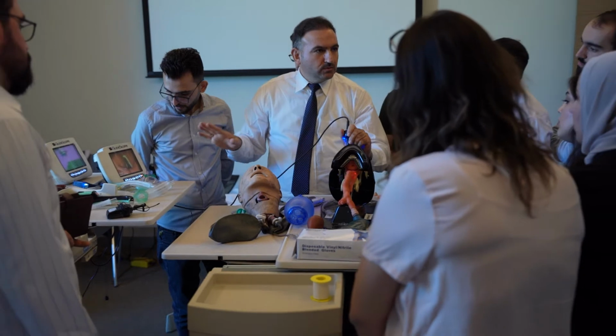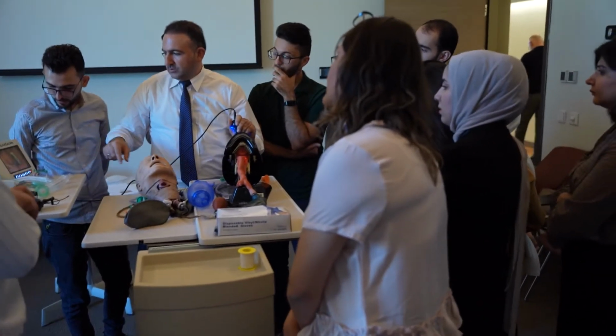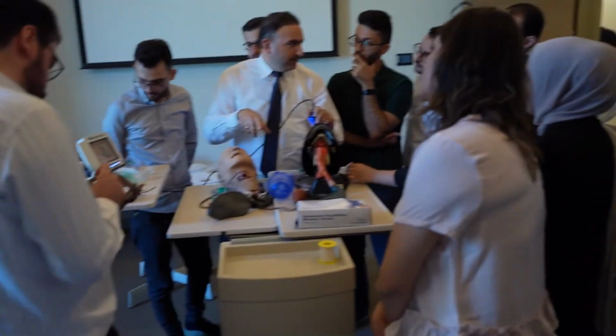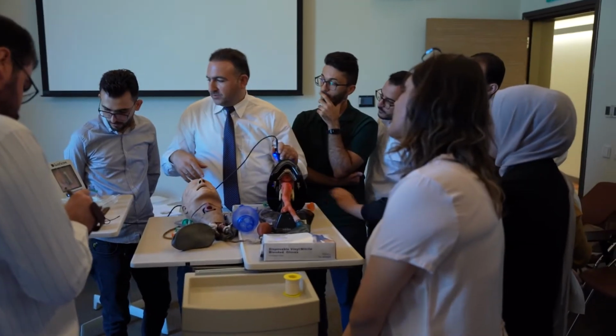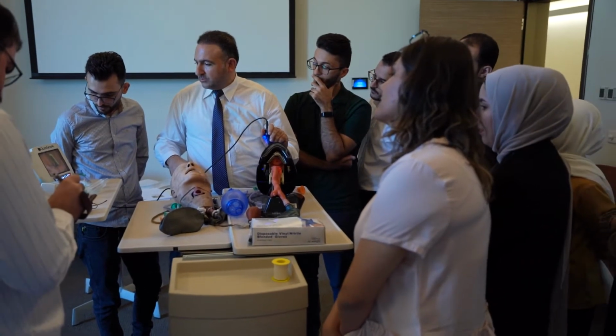But if you don't see the vocal cord, don't try to put it blindly, because definitely you will go to the esophagus. The esophagus is very close, just below the vocal cord.